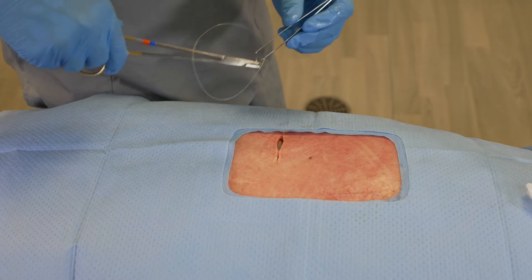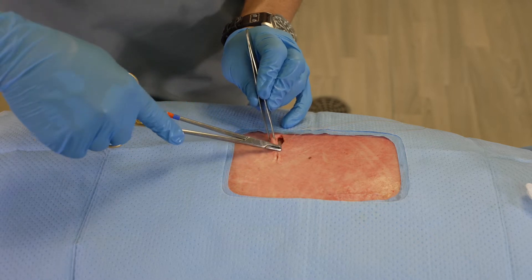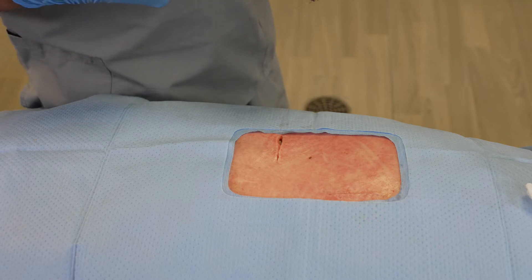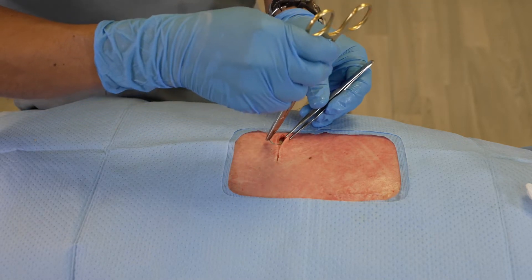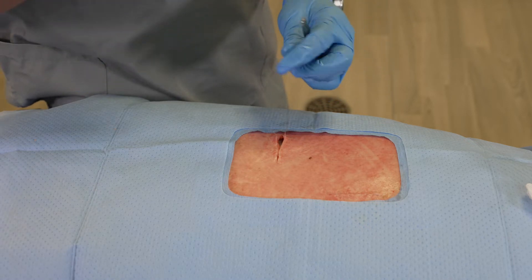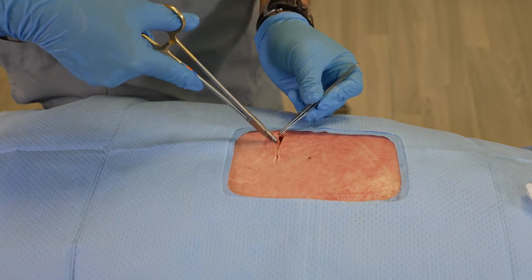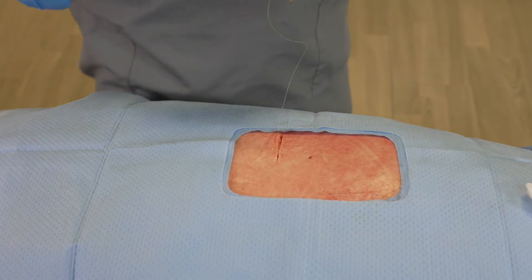While it is impressive that we did not have to create a knot to get this run started, what's even more impressive is that we don't have to create a knot when we finish this run. The barbs within the suture itself hold the wound together very securely and certainly prevent the tissue from coming apart. Our goal is to run the suture, then simply come back through the tissue and cut the suture without the need to create a knot.